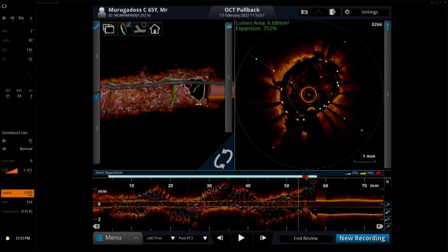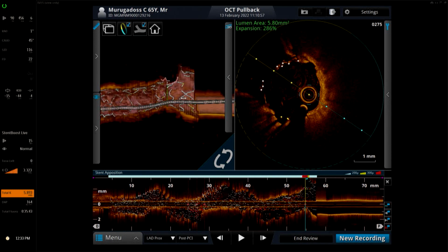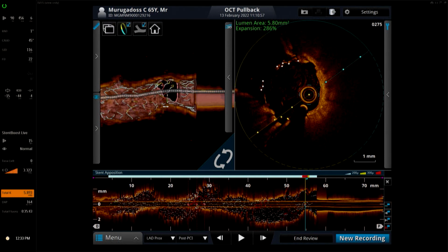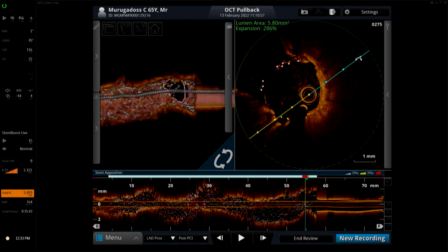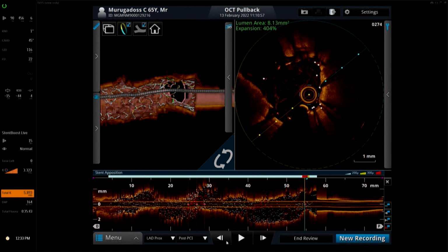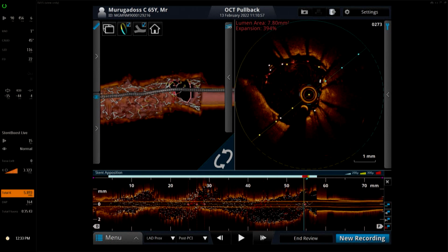There was no big under-expansion of the stent. There are one or two areas where it's not apposed, but that's okay. It's not too bad. And the stent morphology is pretty circular, where we think angiographically there may be a problem. I was not convinced there was a problem needing much attention. However, what I did think needed attention was that we were left with a few more struts across the circumflex, which we don't want. You see that there? Can you show the 3D rendering?